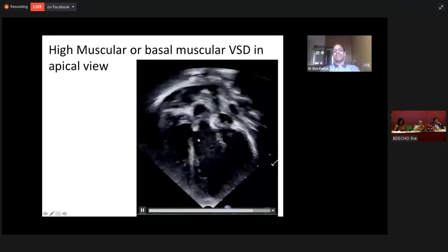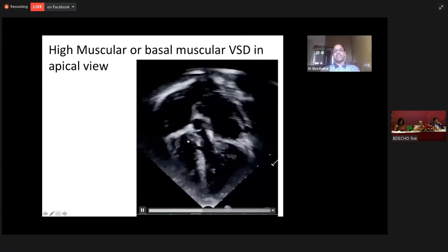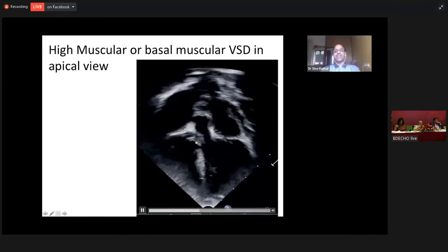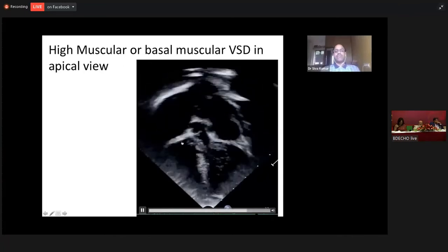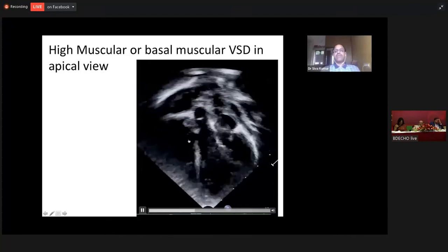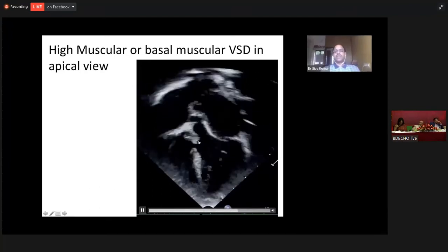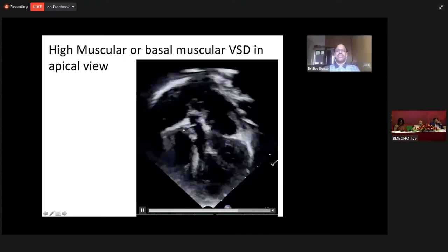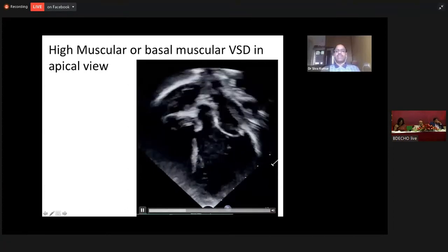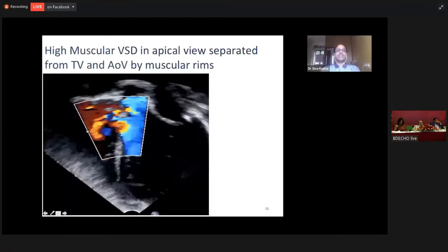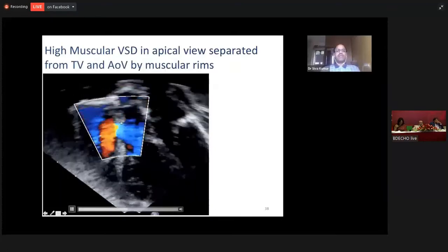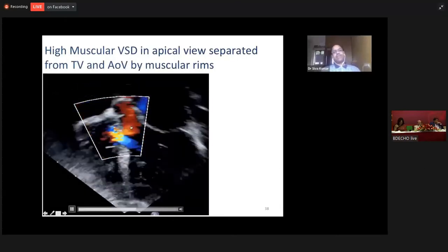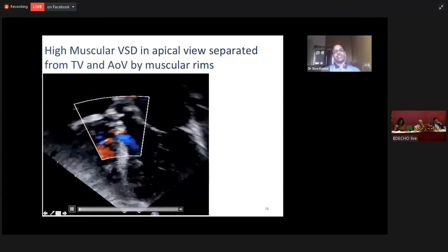Sometimes a high muscular VSD may be mistaken for a perimembranous VSD. If you carefully look at this VSD — it is visualized when you sweep from four-chamber view to five-chamber view, exposing the ventricular septal defect. But it is separated from the aortic valve by a large muscular margin, and it is also separated from the membranous septum with a muscular margin. When you look at it on an apical four-chamber view, you can appreciate the large muscular margin. So this is not a perimembranous VSD, but a basal muscular VSD or a high muscular VSD.